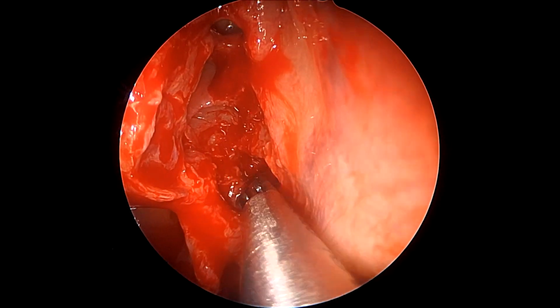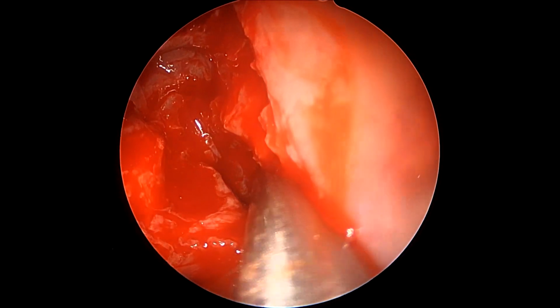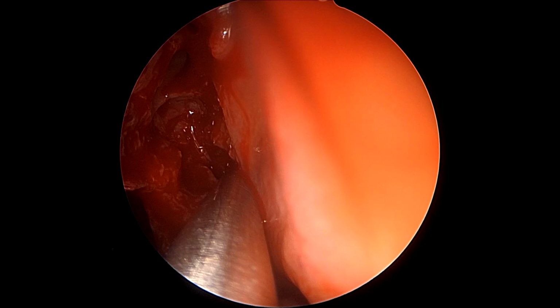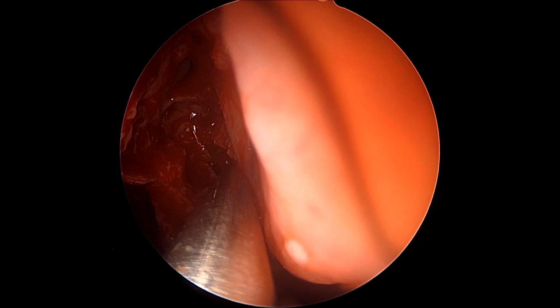Now you might clearly note how our dissection plane is right now straight in the trajectory of the transitional and the horizontal antrostomy ridge. The horizontal antrostomy ridge, corresponding to the medial orbital floor, always points towards the sphenoid ostium level.